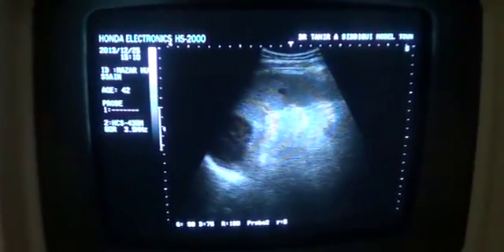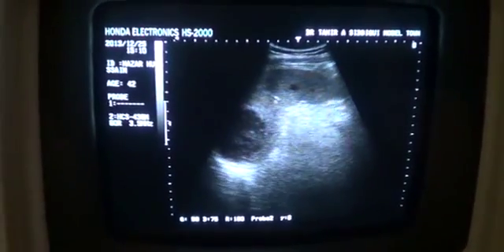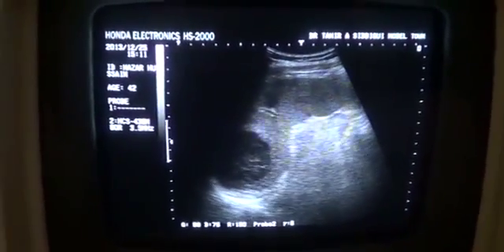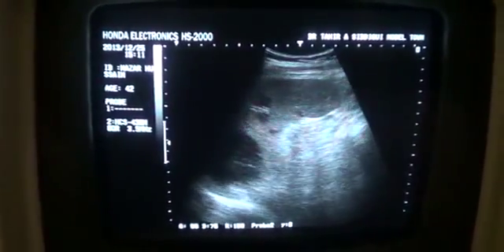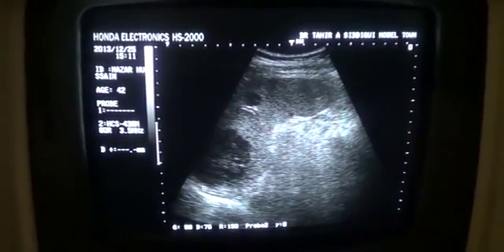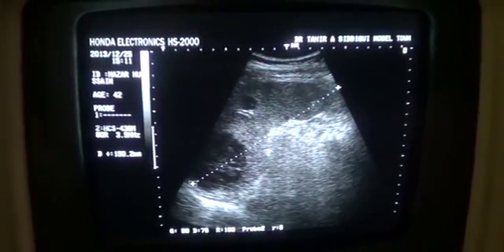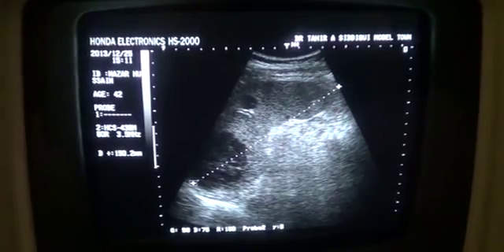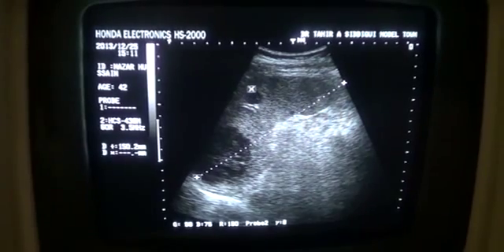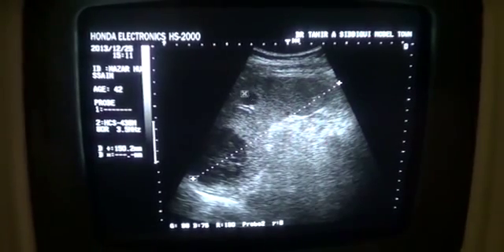This is an ultrasound study of a 42-year-old male. Intentionally showing the spleen first — this is the spleen, this is the left hemidiaphragm, and the spleen is measuring 15 centimeters. Normal should not exceed more than 12 centimeters, so the spleen is enlarged. There are focal lesions — this is one hypoechoic focal lesion.